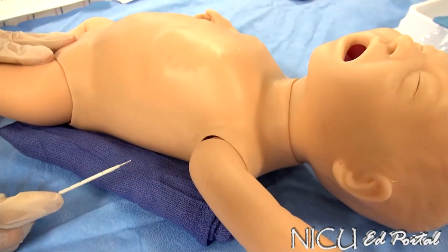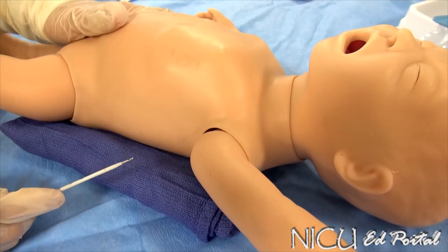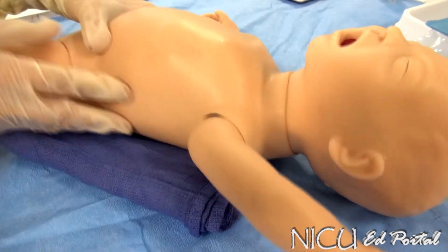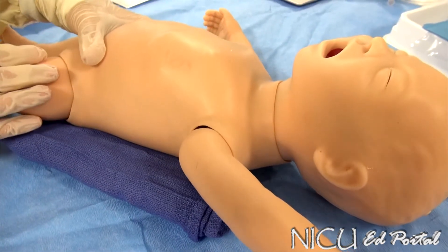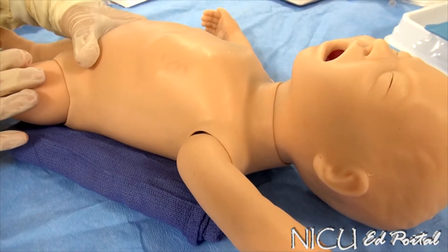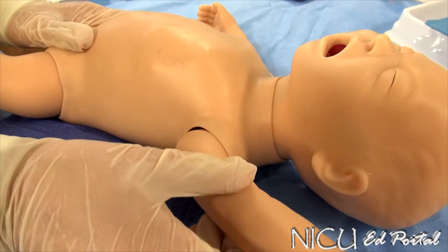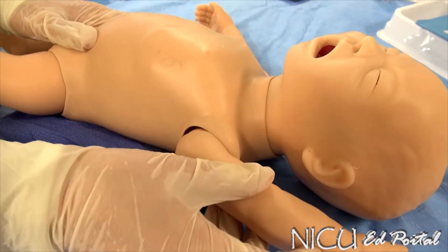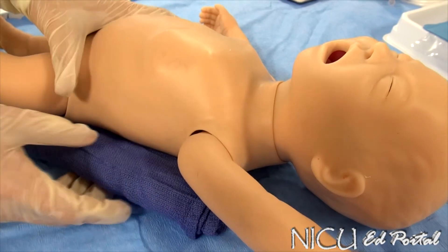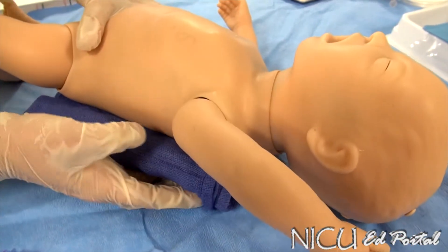It's important to position the baby appropriately before starting any procedure. Assuming this infant has a left-sided tension pneumothorax, you will want to place the arm above the head and secure it, and use a roll to appropriately position.